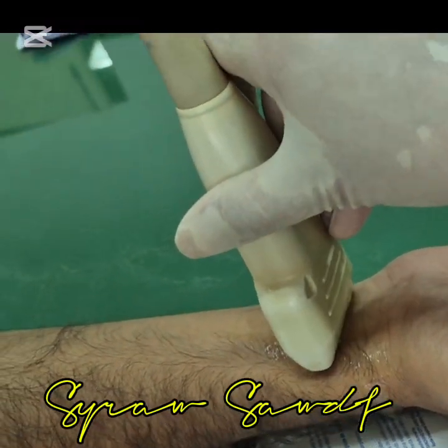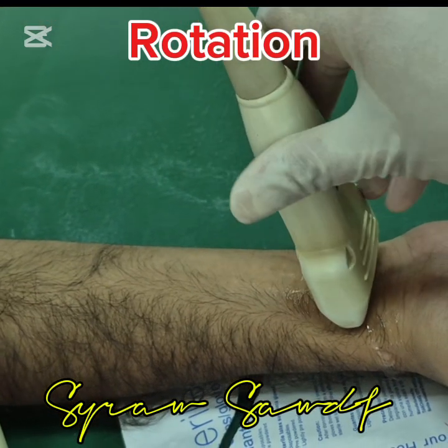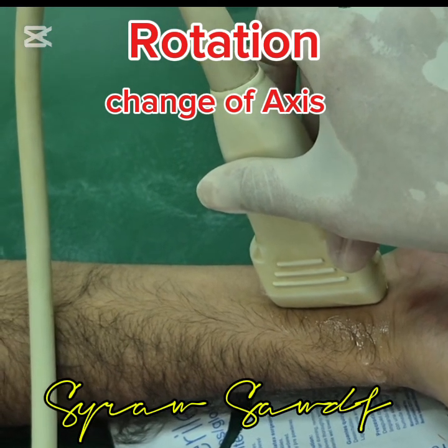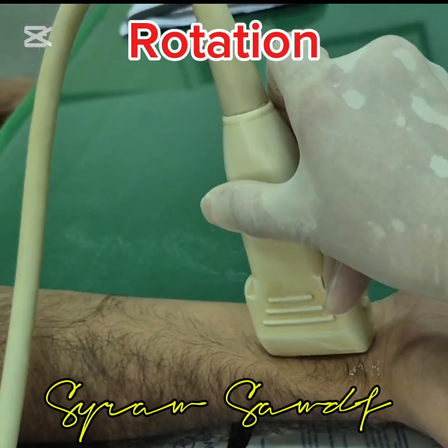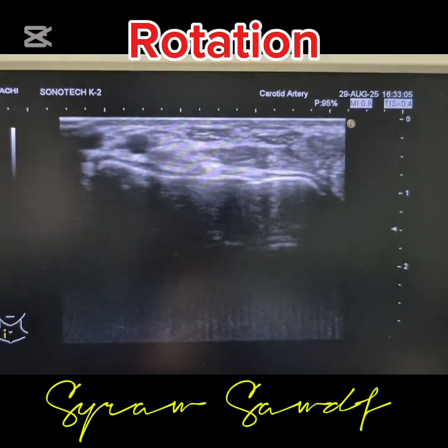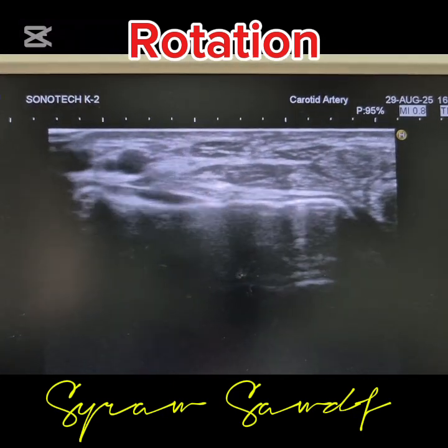I am keeping my probe in the transverse axis, or you can say I have placed my probe transversely. Now let me show you the rotation. Rotation means this. I have rotated my probe from transverse to the longitudinal axis. Let me show you these movements of the probe on the screen. I will change the position of the probe from the transverse to the longitudinal, and just look at the structures and you will be able to see the tendons and the nerve in a longitudinal direction.